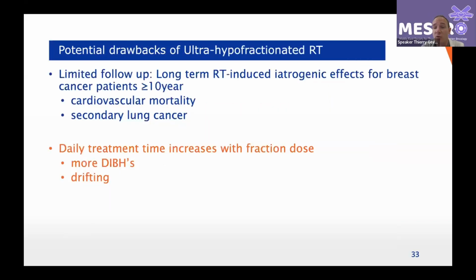We raise the dose, so more dose per fraction, which means that the time patients are lying on the couch will be longer, which means that we will also need more breath holds during the treatment in order to cope with all those uncertainties. The more times patients need to do breath holds, the more they will get tired, or they can get annoyed as well. And so there is a chance there will be a drift. So we have to watch out.